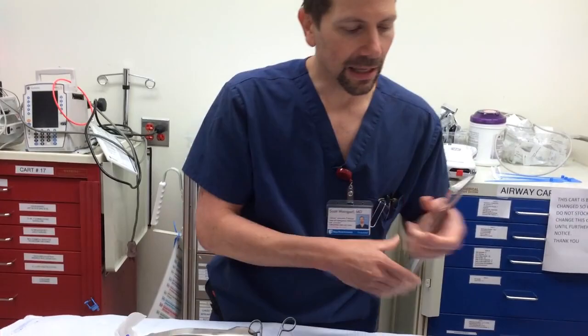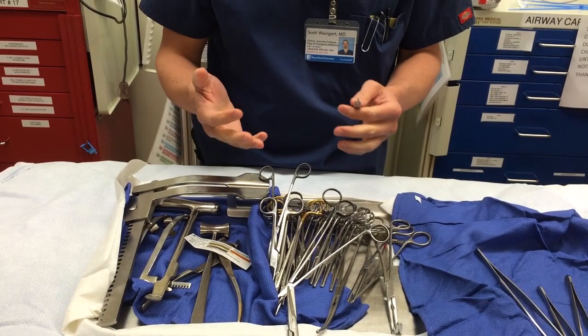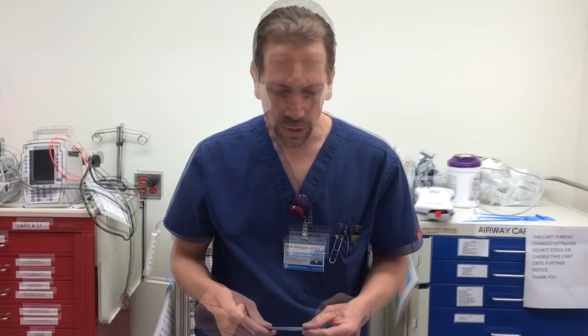The first thing you need is a scalpel. The first efficiency problem in this kit is they have a scalpel handle with no blade, and that's not going to work for an ED. It's very frustrating to have a patient you need to cut into and try to insert a blade onto the handle. You could tape disposable scalpels to the outside of each kit, except people run out of scalpels and steal them off the sides.